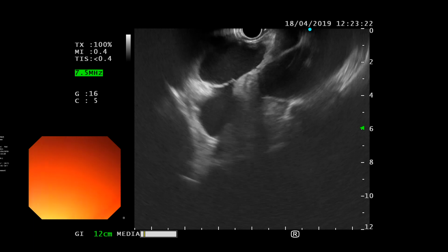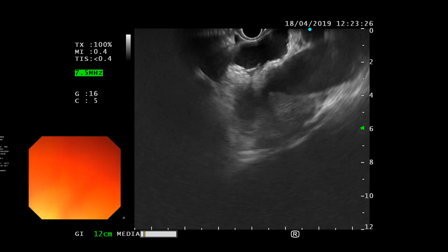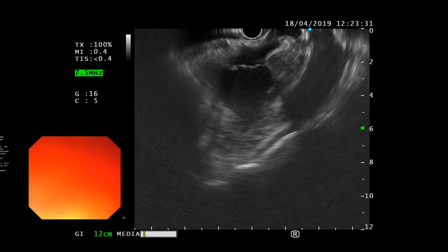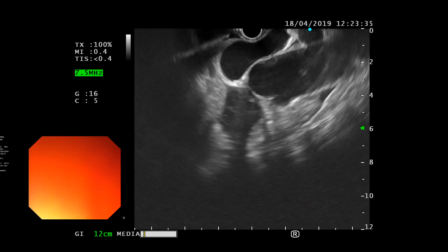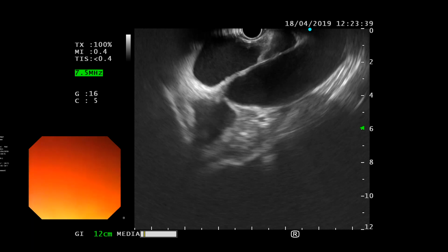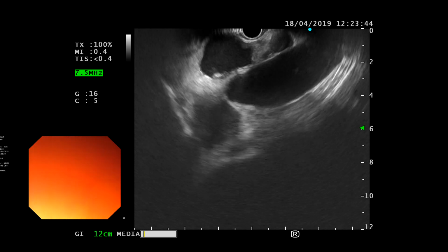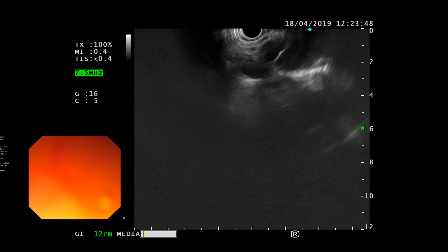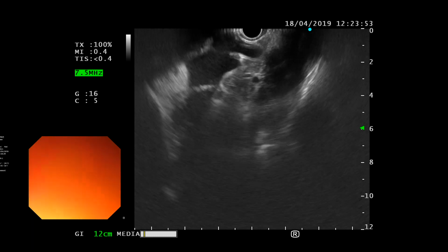There you go. So you basically found your left atrium, and if you spin around, you will see the left ventricle. Okay. So mitral valve, left ventricle. Go clockwise again. Aortic valve and aorta. And right pulmonary artery. I need to withdraw. Just withdraw a tiny bit, and this is the subcarinal space. And if you just spin gently, clockwise, counterclockwise, go the other way now. Yeah, that's it.